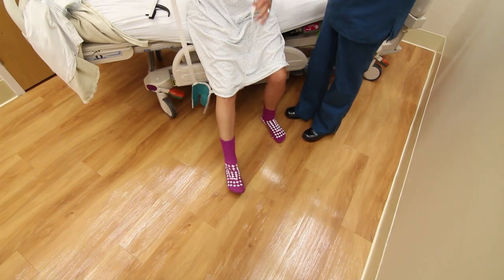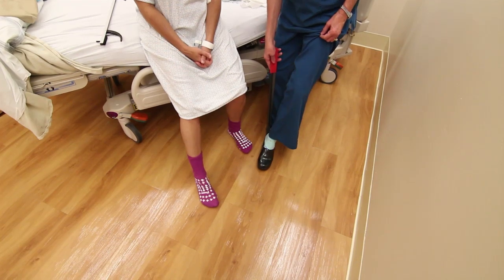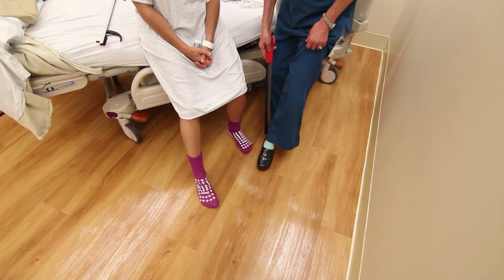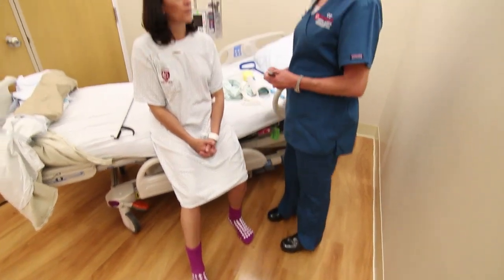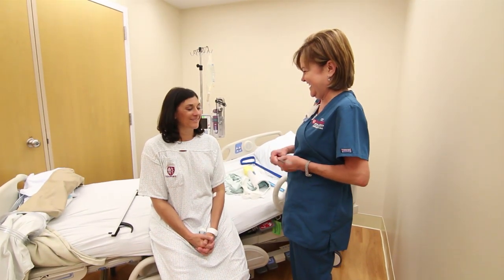A sock aid or dressing stick can be used to put on and take off socks. Shoes can be slipped on and off with a long shoehorn or with a reacher. Elastic laces can also make it easier to slip shoes on and off.